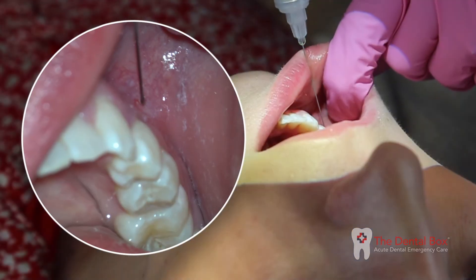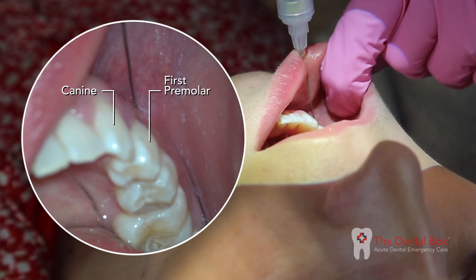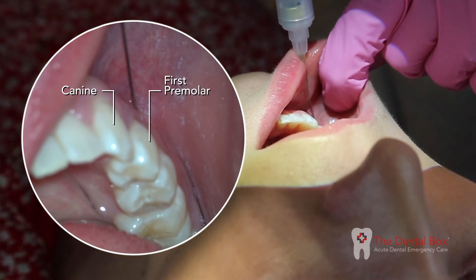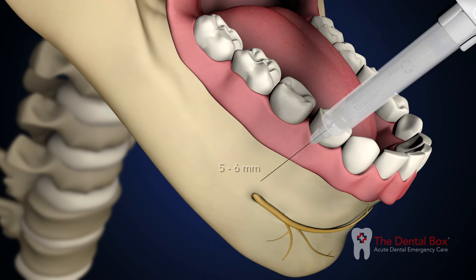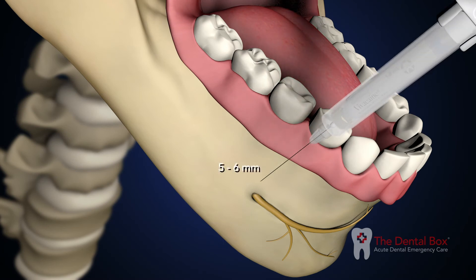Penetrate the mucous membrane at the canine or first premolar, directing the needle toward the mental foramen. Advance the needle slowly to a depth of about five to six millimeters.